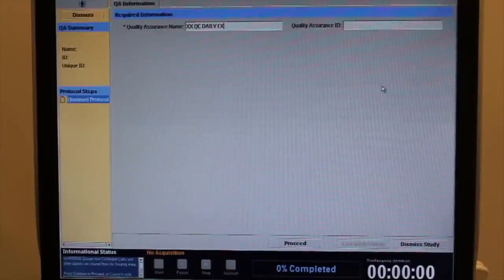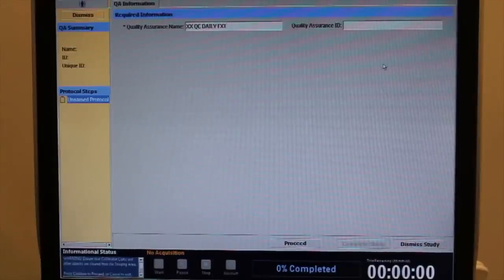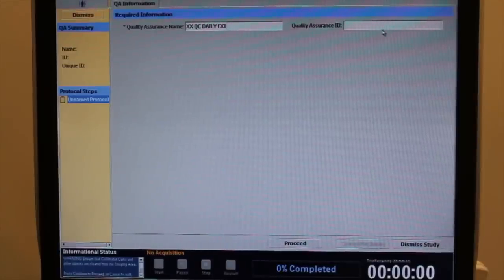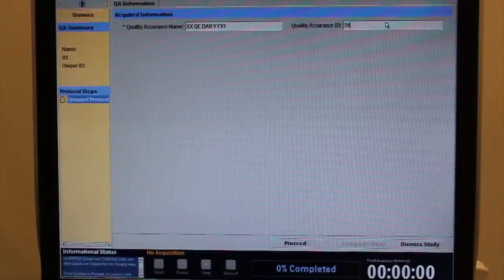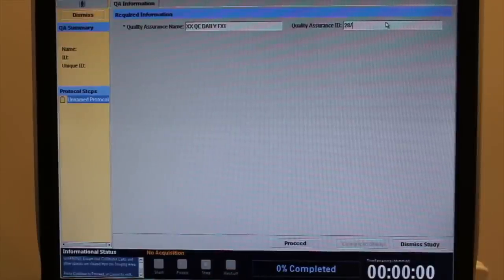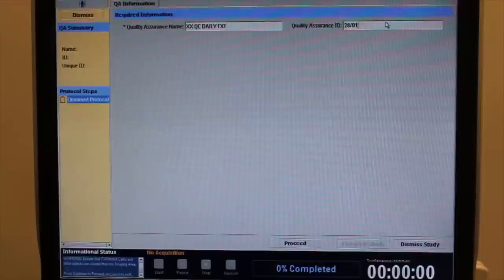Type in the name of the study: capitals, double x, space, QC, space, daily, space, ext for extrinsic.